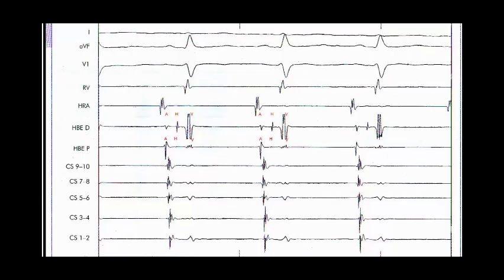The pathway of conduction, is it the normal pathway, the normal conduction system, or do I have an extra pathway of conduction? This extra pathway of conduction may be the substrate of the tachycardia. Either it's an accessory pathway or an AV nodal pathway, the cause of AVNRT, or something like this. So I am pacing to detect abnormal conduction pathways that may be the substrates of the tachycardia.